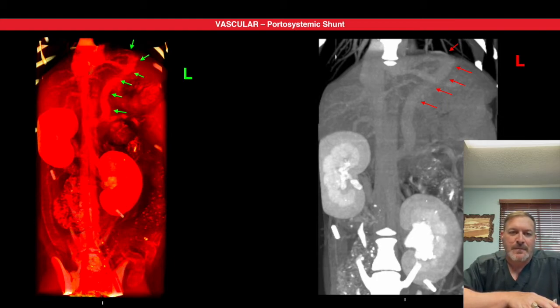So anytime that we've got pups coming in the door exhibiting symptoms that there might be a shunt, typically we've been tasked with grabbing the ultrasound. Well, those of us who've done quite a bit of ultrasound over the years still struggle with finding shunts using ultrasound. There are some who are super talented because they kind of specialize in shunt scanning with ultrasound. So, they can see it and diagnose it a lot faster than those of us that don't see it as common or as often.